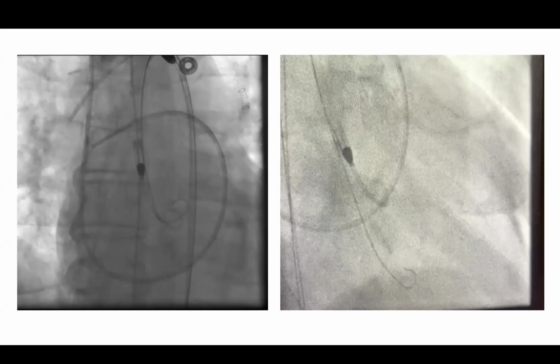Yes. And if it's kinked, you can just pull it out. Sometimes that kink doesn't get you pulled all the way down, and that's when you need to snare to straighten it out, and then that's when you get in trouble.